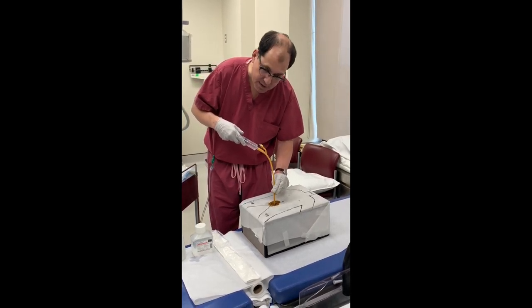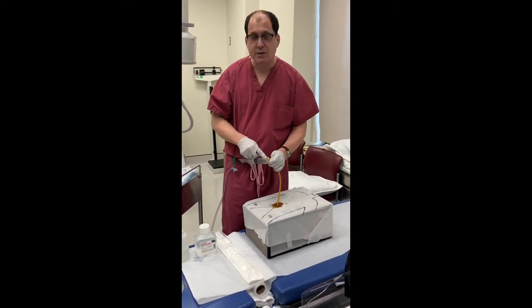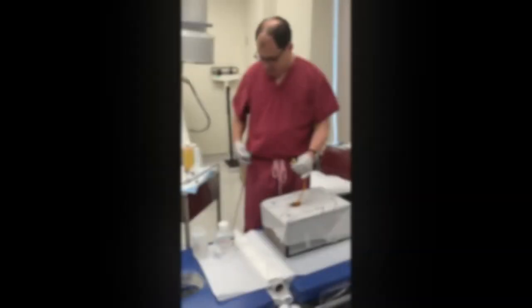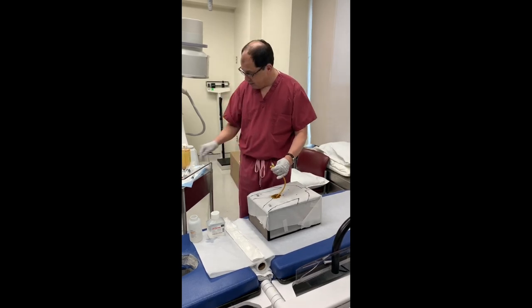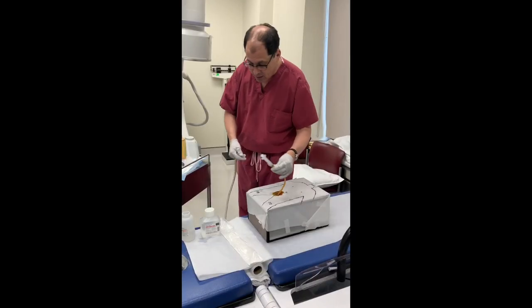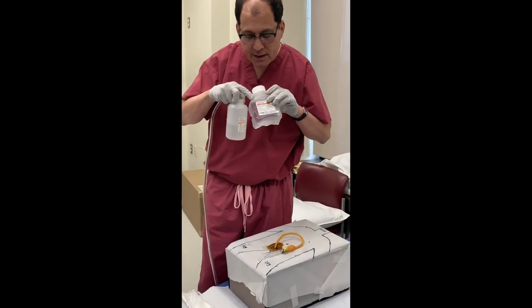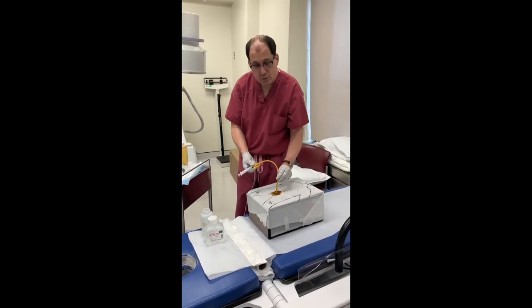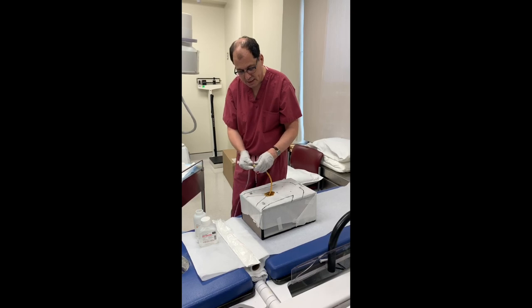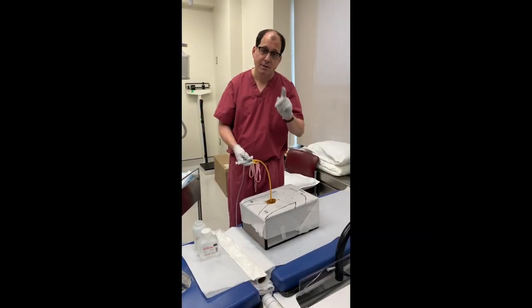Many times you'll feel a little resistance right there — if you feel that, inflate your balloon, then reconnect your catheter. The keys are: fill the balloon not with saline or salt water, but with sterile water. Irrigate it — fill it with one syringe full before you change the catheter. Then you can confirm by irrigating that it's in place. You can do it, it's not that difficult, and I'm confident you'll do a good job.